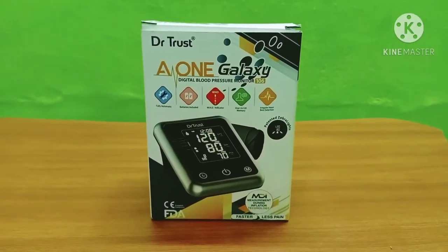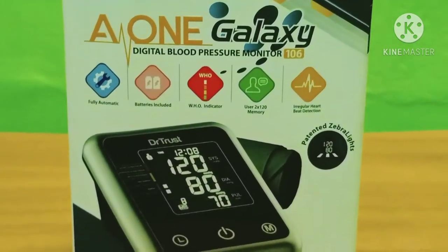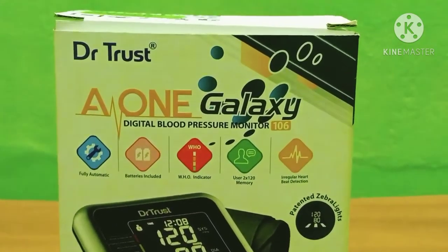Hello friends, welcome to Tamil Mojotik. We are going to talk about the Dr. Trust A1 Galaxy digital BP machine. Let's go to the video.